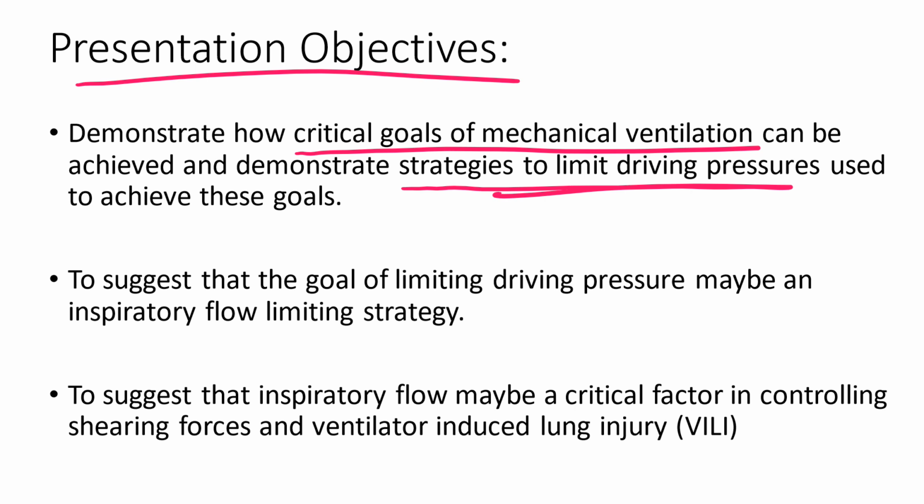So any of the suggestions that I'm making about maintaining or changing driving pressures, it's assumed that you would know how to alter the rate and tidal volumes to achieve the therapeutic goals for the patient. Where I'm going to be exploring a little bit is to suggest that the goal of limiting driving pressures may be an inspiratory flow limiting strategy. All right, that might be the outcome.